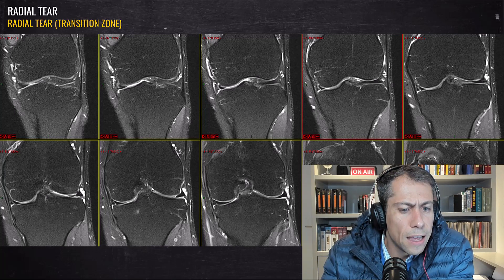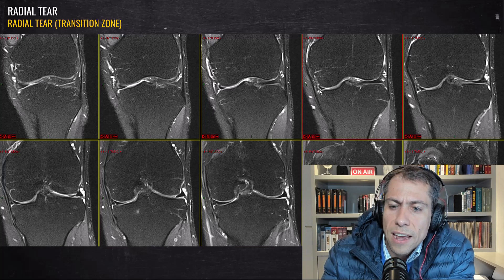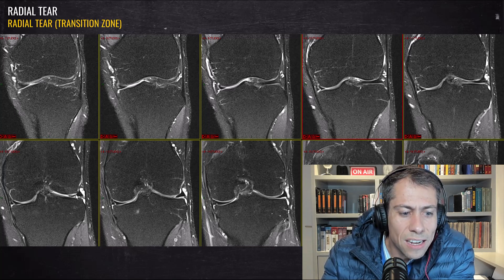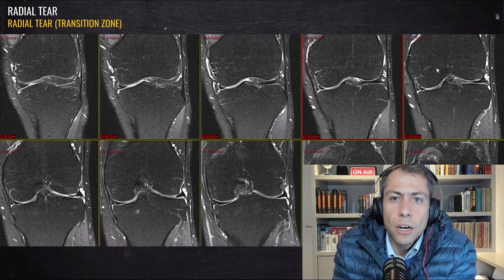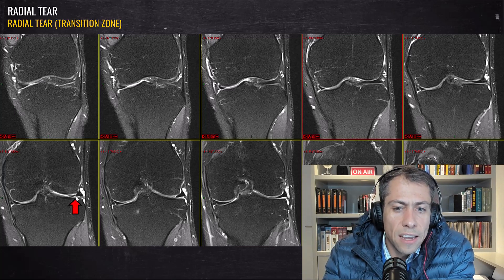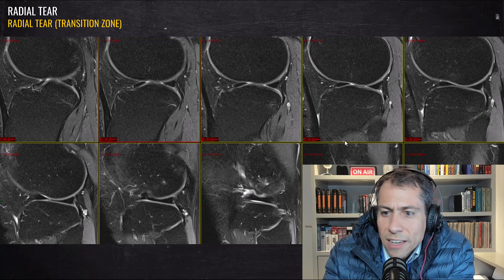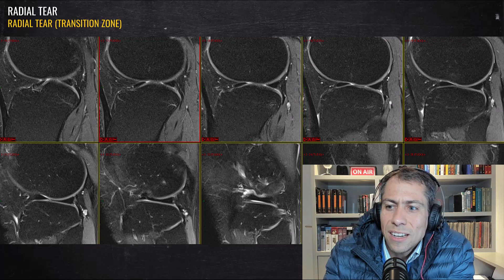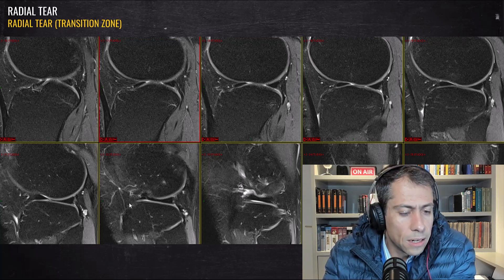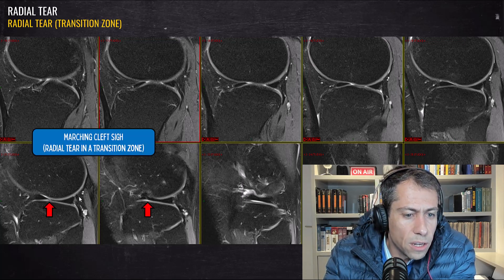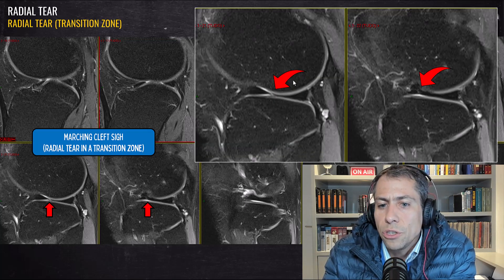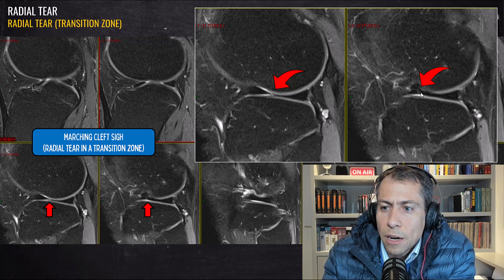Let me show you another case. This patient had a knee trauma with rupture of the anterior cruciate ligament. There is also a longitudinal vertical tear in the medial meniscus. But here in the lateral meniscus, we can see a tear between the meniscal body and the anterior horn, in the curve between these two regions. Here is the tear. When you go to the sagittal plane, we can see a small irregularity here and here — this is the marching cleft sign of a radial tear in the transition zone between the anterior horn and the meniscal body.